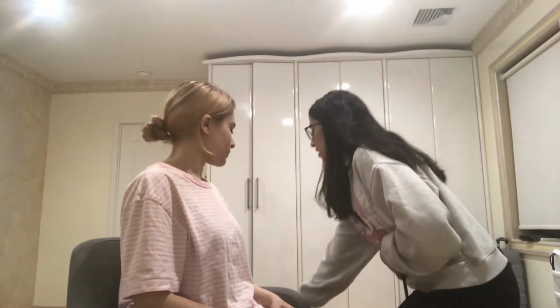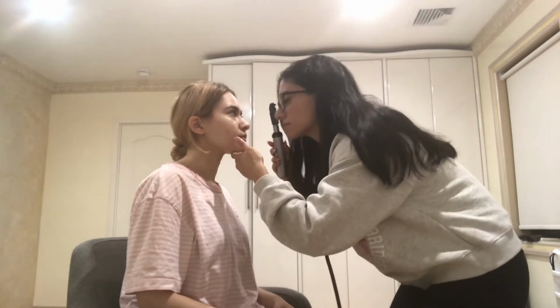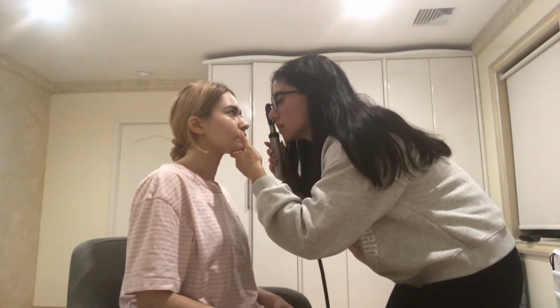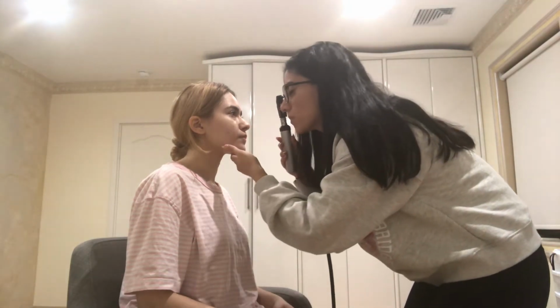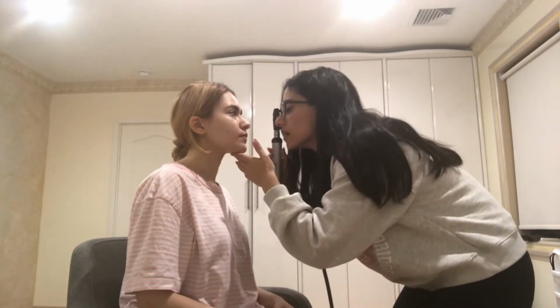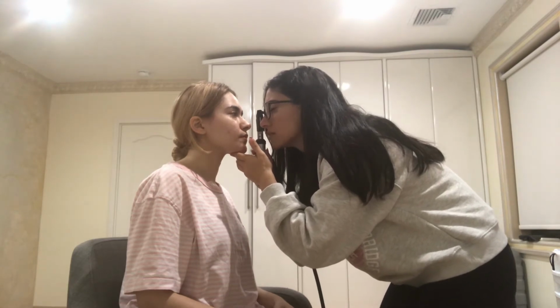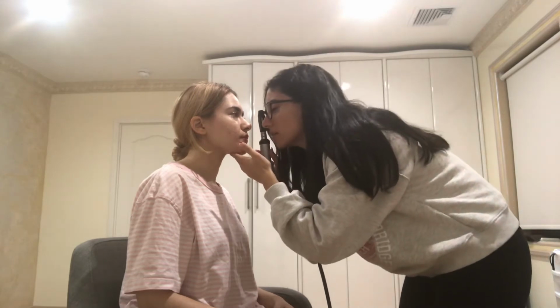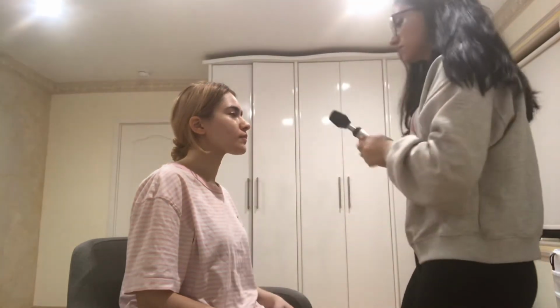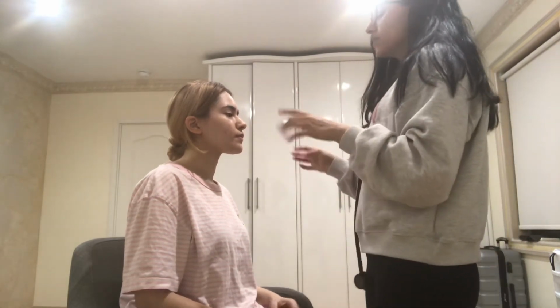I will now use the ophthalmoscope to perform the eye exam. We are looking for the red light reflex in both eyes, which is a normal finding. And now I will look for the optic disc following the blood vessels. Optic disc is orange-red in color, and the blood vessels are visible in both eyes. And then we will move on to the nose.